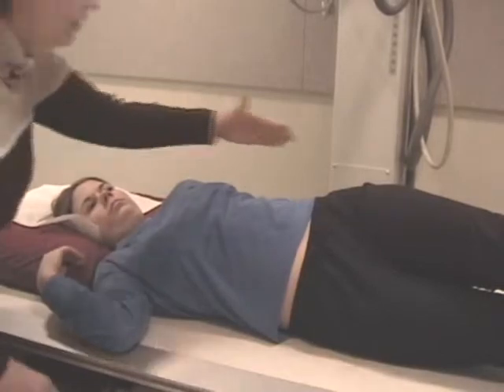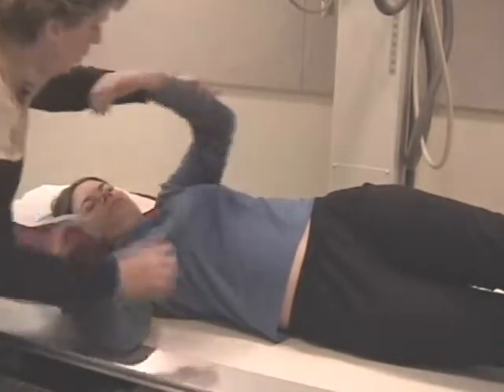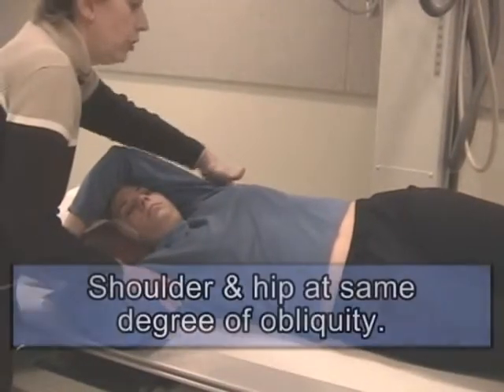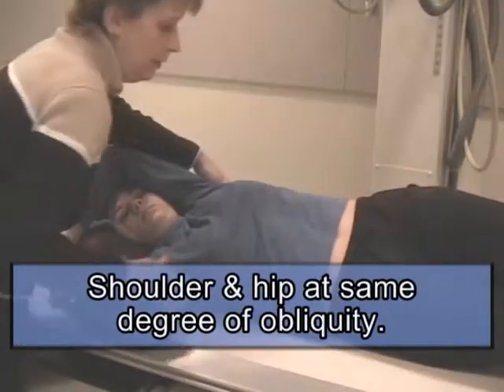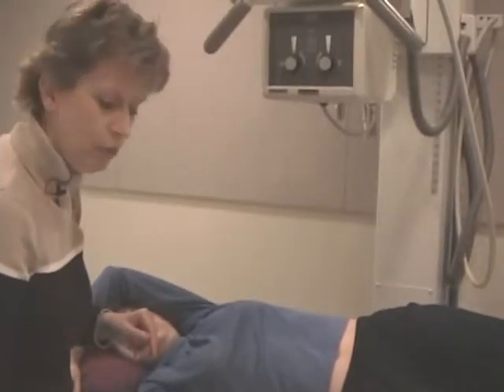I've kept the body at the entire same degree obliquity. Let's bring this arm up and over. You can just put it up above your head. That's good. So the shoulders and the hip are at the same degree of obliquity. Here we go. Okay? Again, the shoulders and the hips should be at the same degree of obliquity.